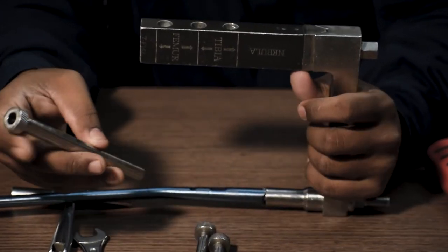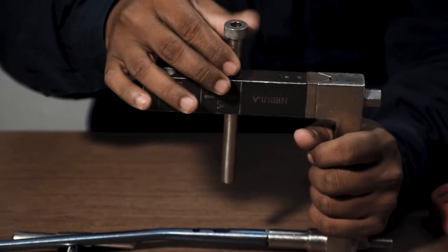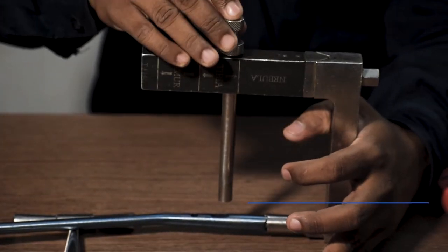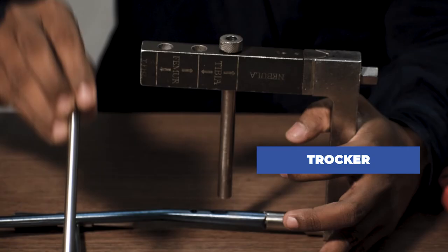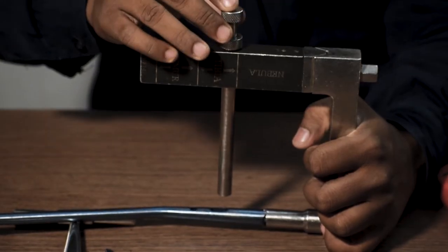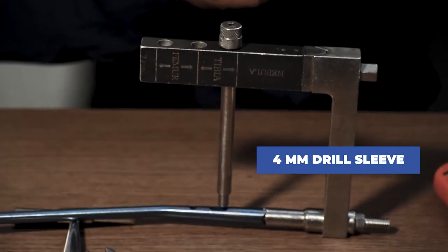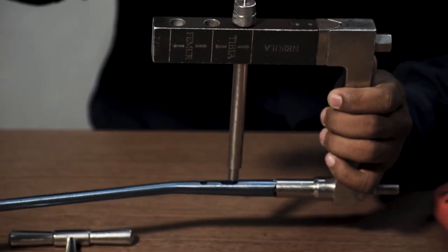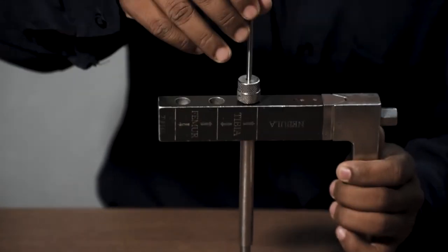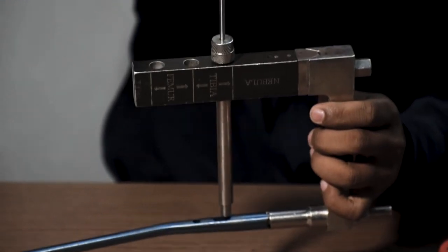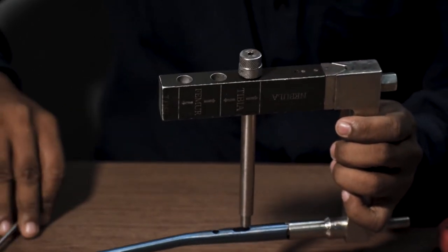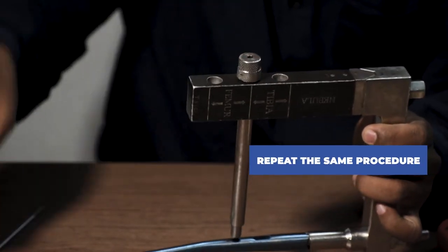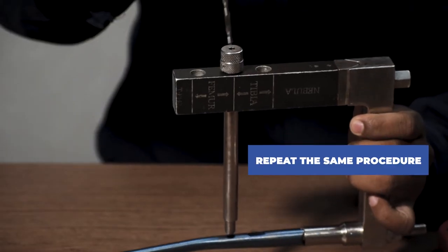Now in order to test, first protection sleeve is inserted. After that a trocar is inserted through the protection sleeve. Then the trocar is removed and the 4 mm drill sleeve is inserted in the protection sleeve. After that, a 4 mm drill bit is used to drill through the hole. This is how the tibia jig is checked to see that it is working perfectly fine. The drill bit is going through and there is no obstruction. Now the same procedure is used to check all the other holes.